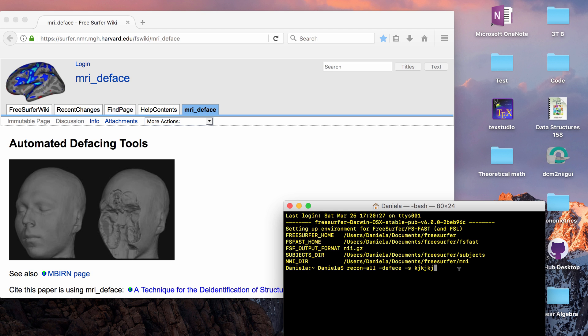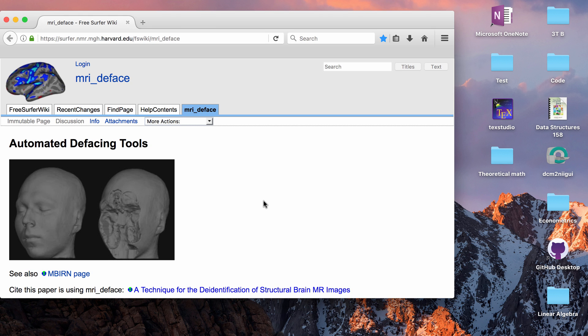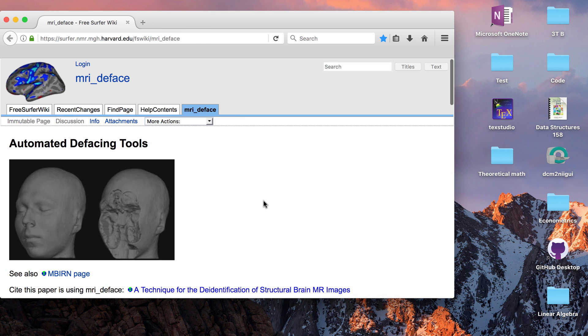If you call the deface tag from ReconAll, what it will do is it'll take your file called orig.mgz which is in your MRI folder and it will add an orig underscore deface.mgz so it will deface an mgz file but you can also input a nifty file and it will deface that.